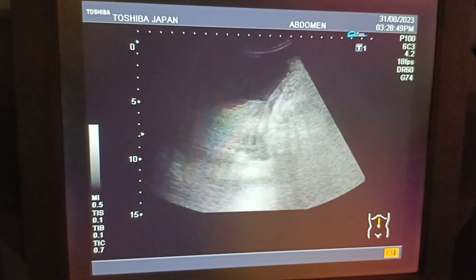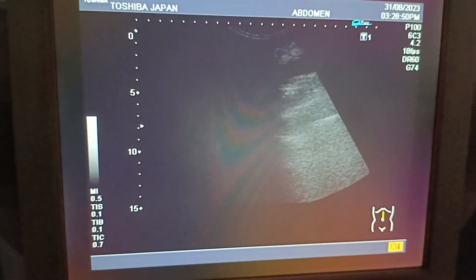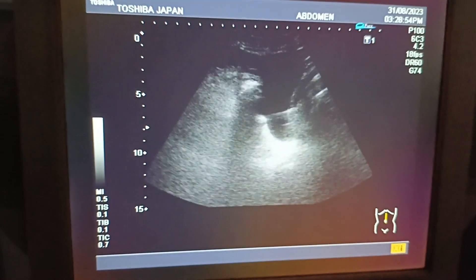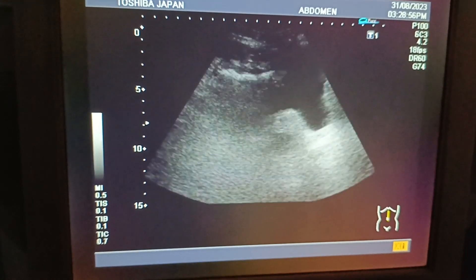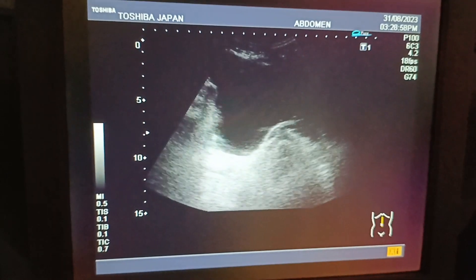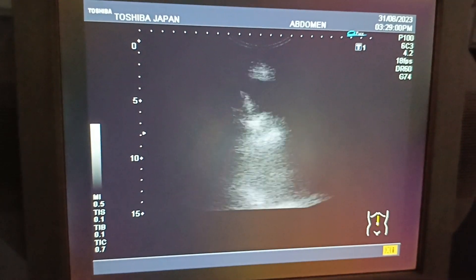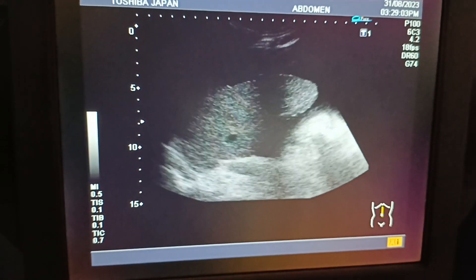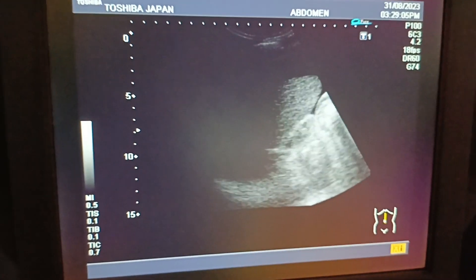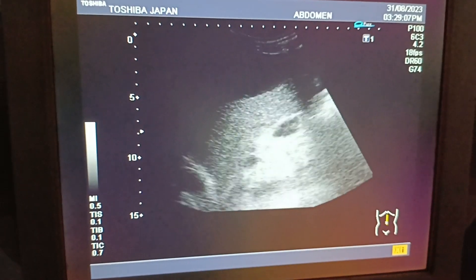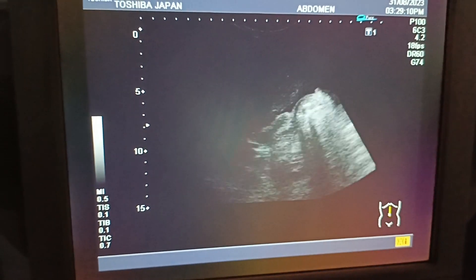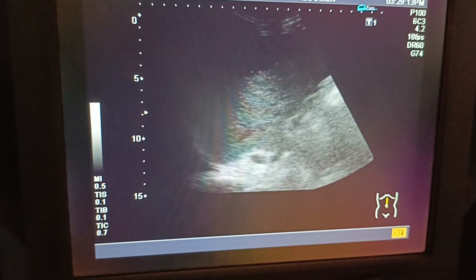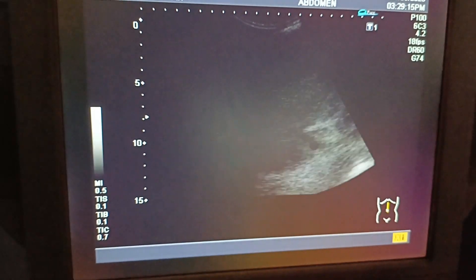The portal vein diameter is at the upper limit. This is the massive abdominal and pelvic ascites. You can see the urinary bladder and fluid within the pelvis. The right kidney is poorly visible because it has been pushed back by the pressure of the ascitic fluid.